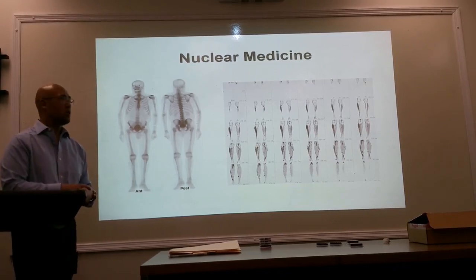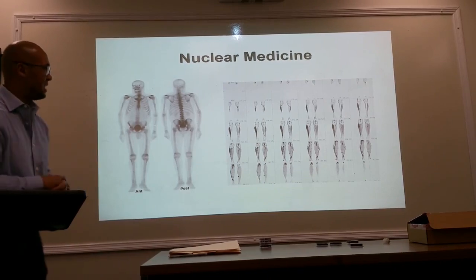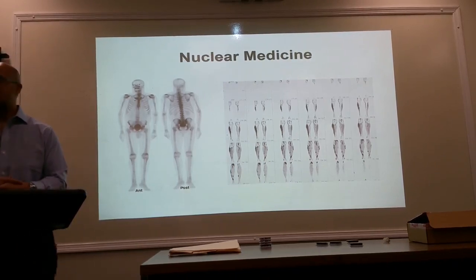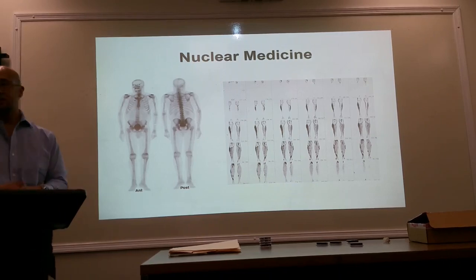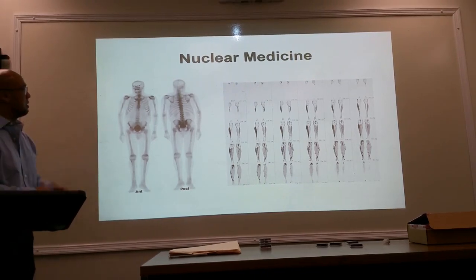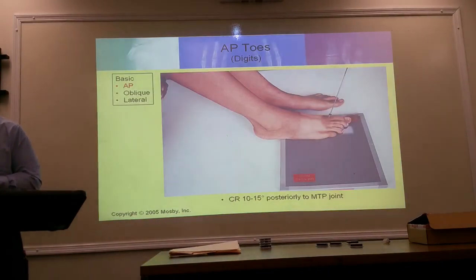Unless you're used to looking at a nuclear medicine study, it simply looks like a bunch of dots. But those dots can translate to where there's a disease process that may be occurring. But I'm not going to spend too much time on that. Again, it's your body that is emitting the radiation.